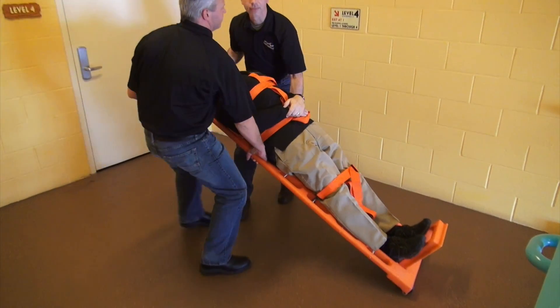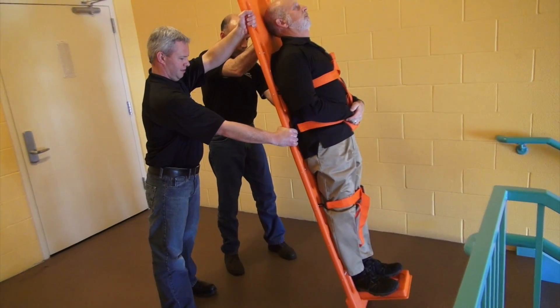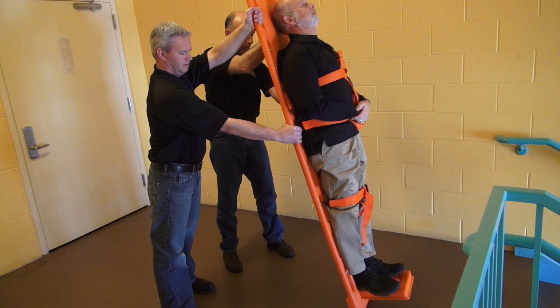Lift slowly and at the same speed so the patient does not tip. When the lift is complete, your arms should be straight with locked elbows.